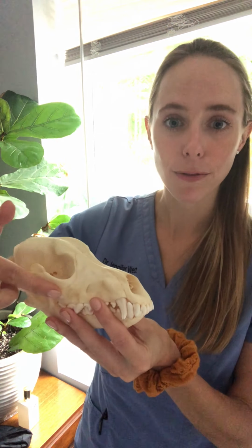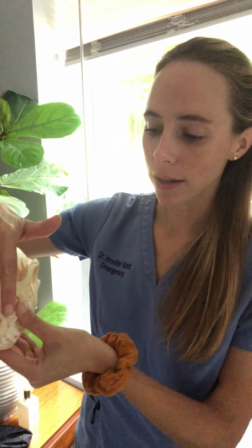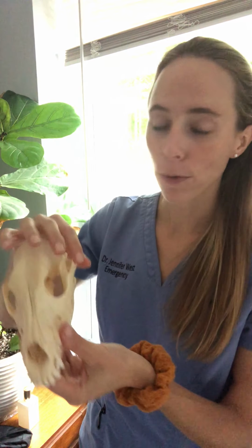Now, a CT or CAT scan can be used if you're trying to view all the little segments of the bone and evaluate the tooth roots or fractures. Bony changes can still be helpful for a CAT or CT scan, but an MRI is the superior modality to look at the brain as well as examine sometimes the spinal cord.